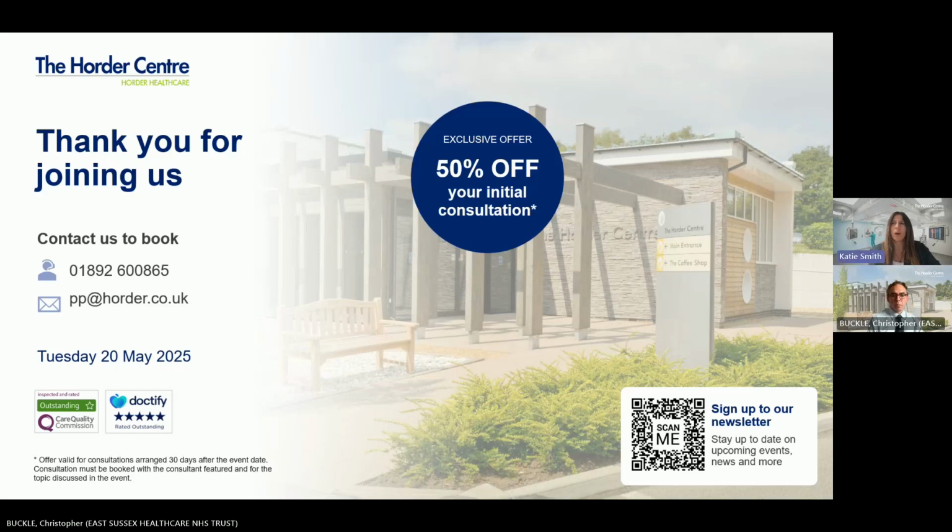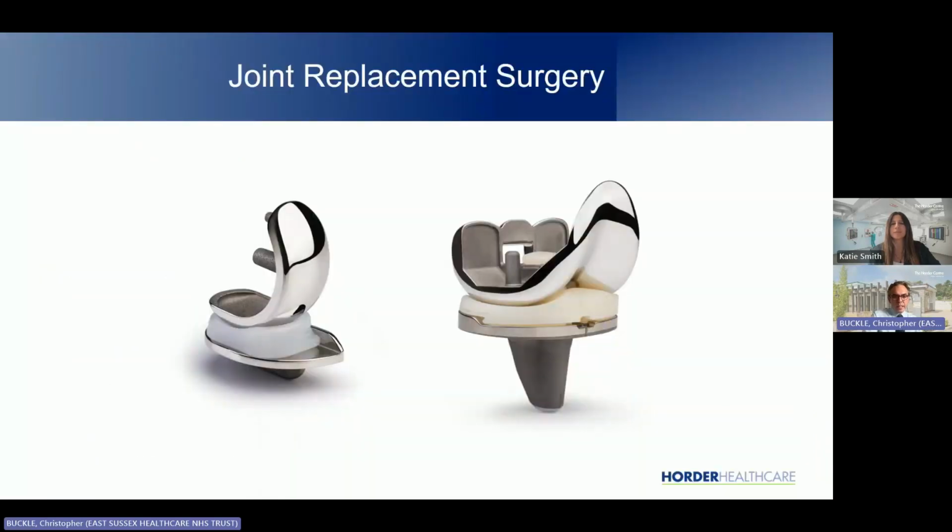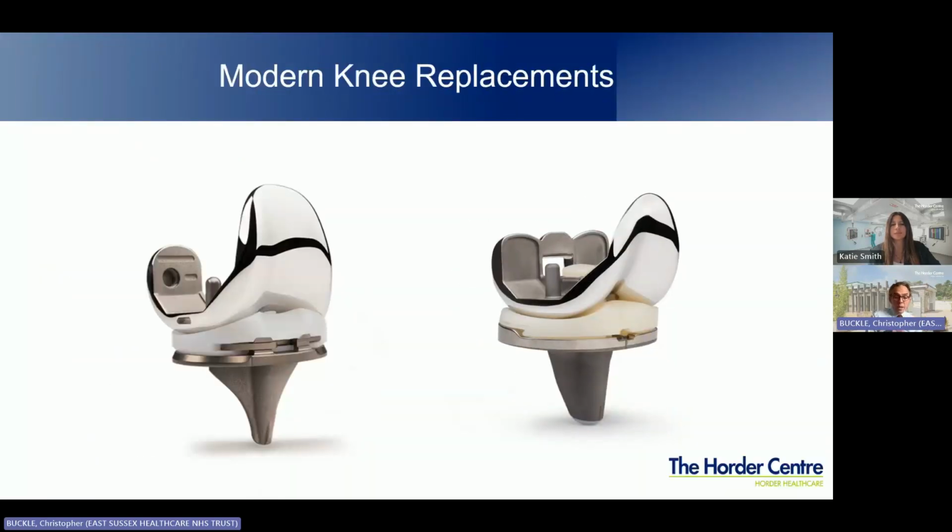Interesting question here of what happens to the cruciate ligaments? So traditionally, the cruciate ligaments are partly resected. With all the knee replacement designs, where are we? The cruciate ligaments sit in the middle of the knee. They are two big ligaments. One of them, your anterior cruciate ligament, is resected, and that allows the technical bits of the procedure to occur. So in order to be able to move the joint, that is resected.